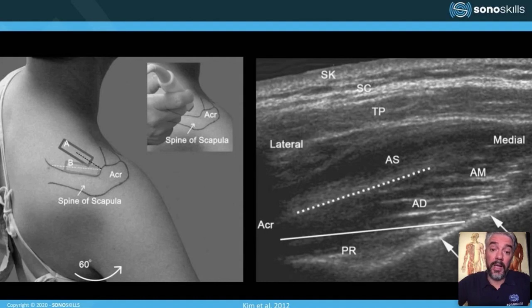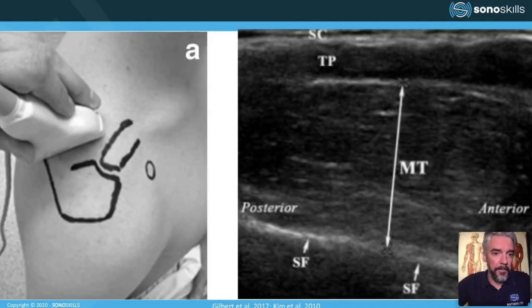But I do look at this image because what we want to see is nice crisp lines, the fibers, but also the internal aponeurosis. And this can help you in diagnosing only by looking at it. In general, if there is a fatty infiltration, which could be really interesting to know if the surgeon is considering a surgery in case of a supraspinatus cuff tear.